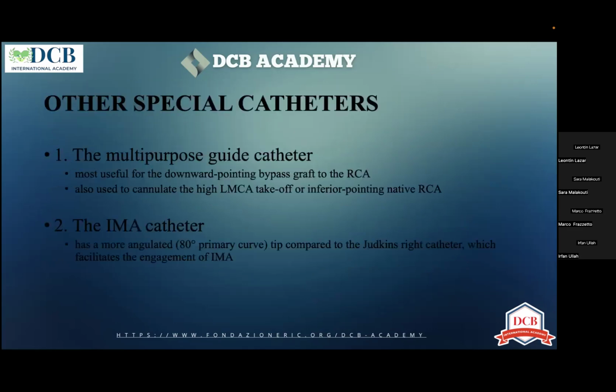Some other special catheters are the multipurpose guide catheters, which are most useful for the downward pointing bypass graft to the right coronary, and they are also used to cannulate the high left main coronary artery takeoff or inferior pointing native right artery. Also, the internal mammary artery catheter is suitable for left internal mammary artery PCIs, and the curve facilitates the engagement of this artery without damaging it.